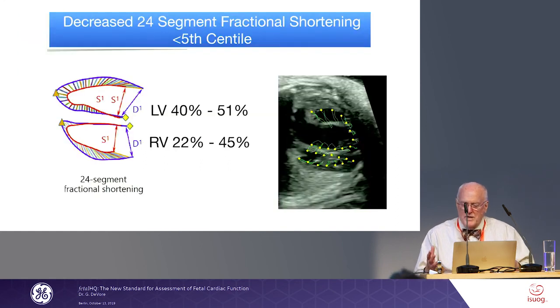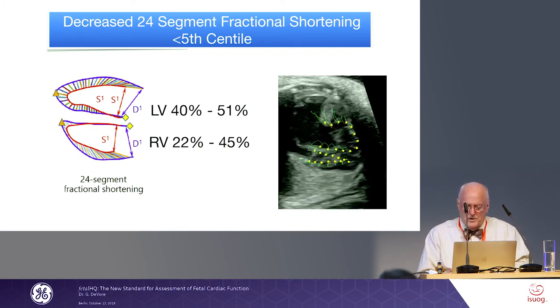And so finally, we came up with a profile. Basically, the left heart is smaller, and the left heart is more flattened in shape. The right heart is bigger, and you have changes in contractility in both ventricles. So you say, that's interesting. I kind of thought that. Let's ask the final question here.